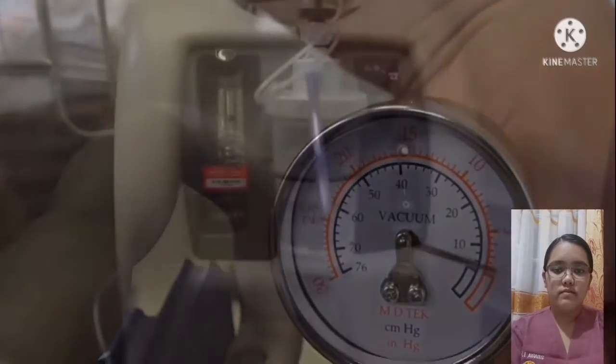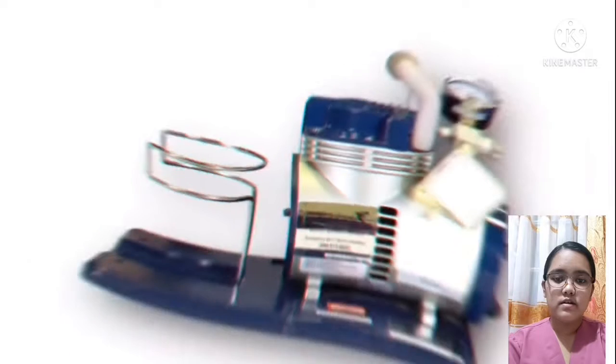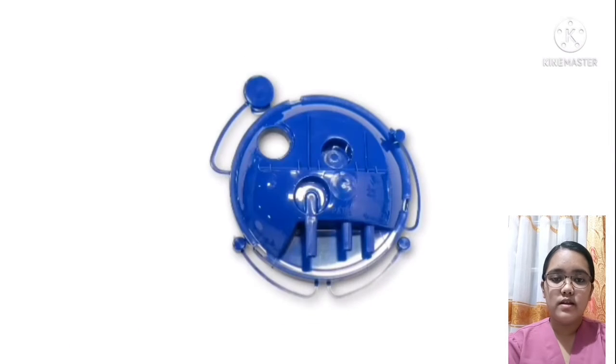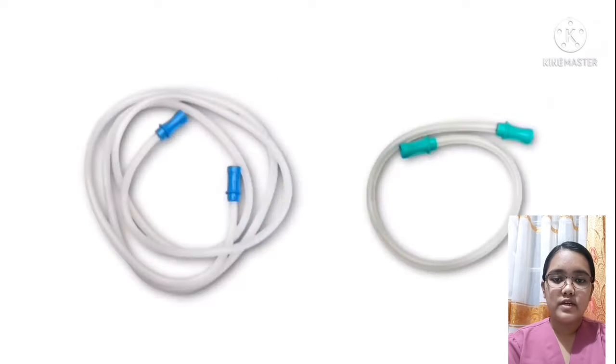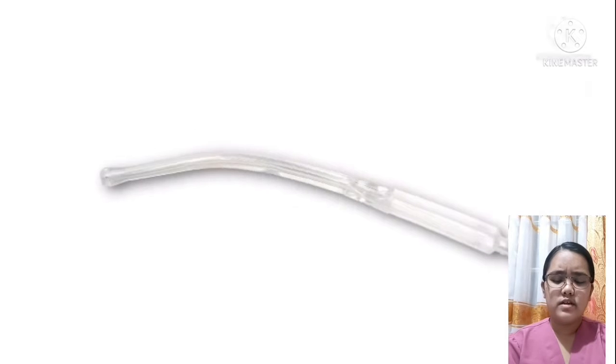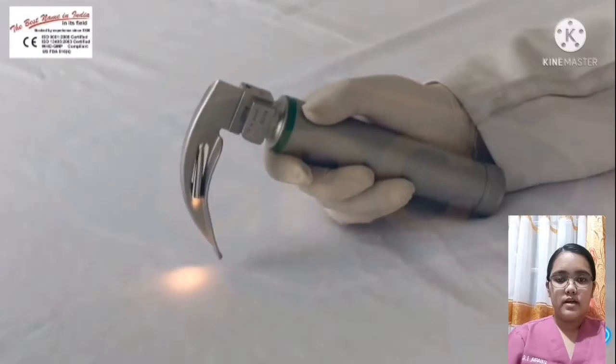Prepare the patient for intubation and prepare the suction apparatus: the machine itself, the collection container, leads to the canister, connection tubing, and Yankauer suction tip. Before using the laryngoscope, we also need to check if there is a light.